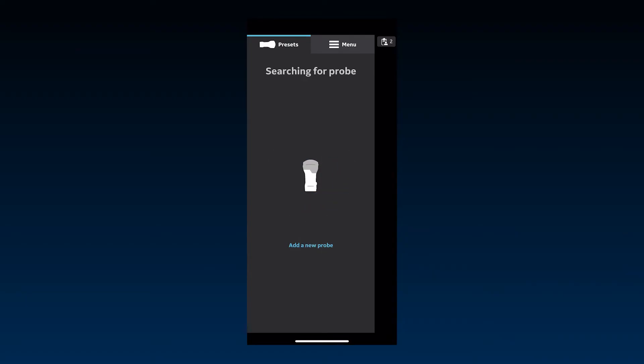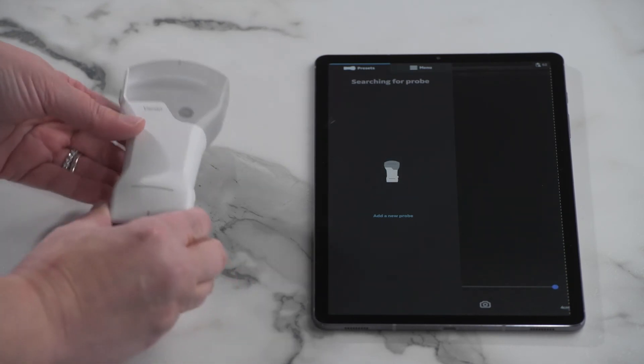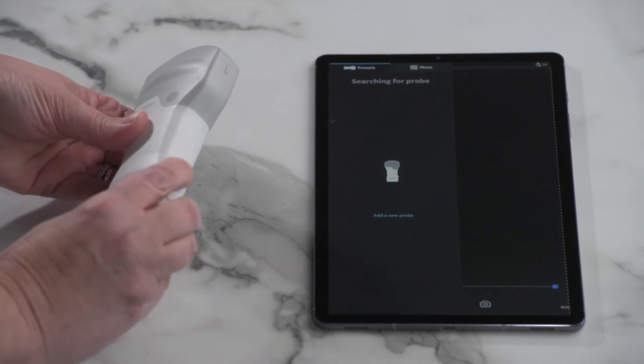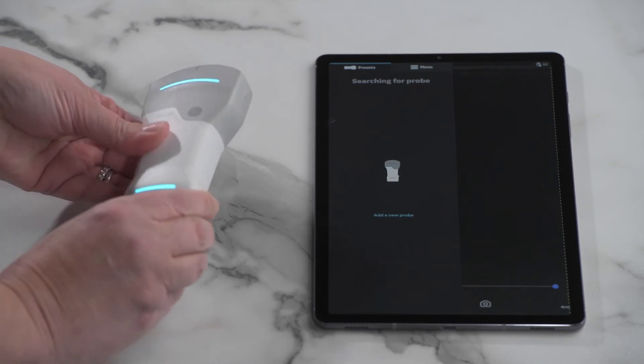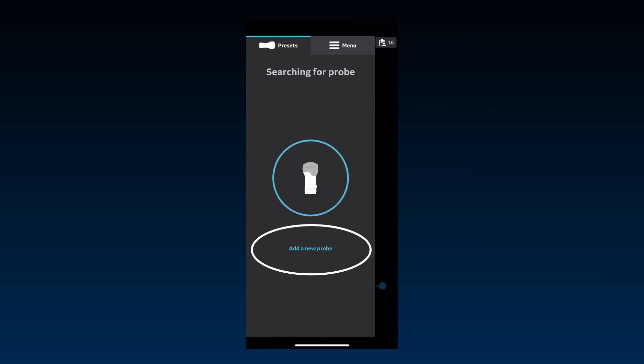If no probe is detected near the display device, the app will continue to search for an available probe. Ensure that the probe is turned on and move it close to the display device. Orient the probe and app display device with respect to one another. You can always press Add a probe in the side panel if you're having issues.